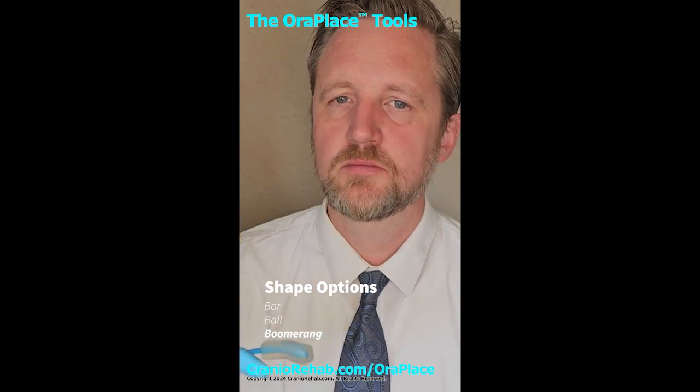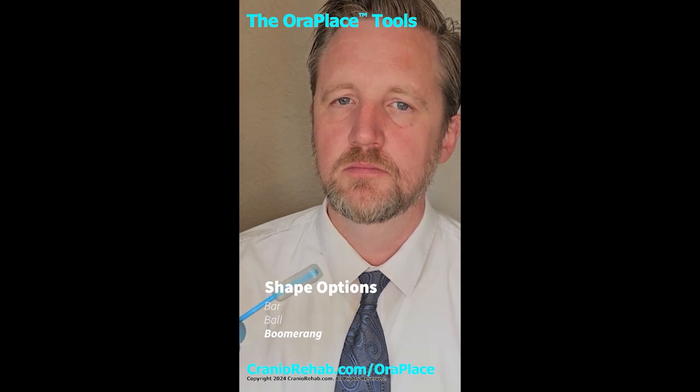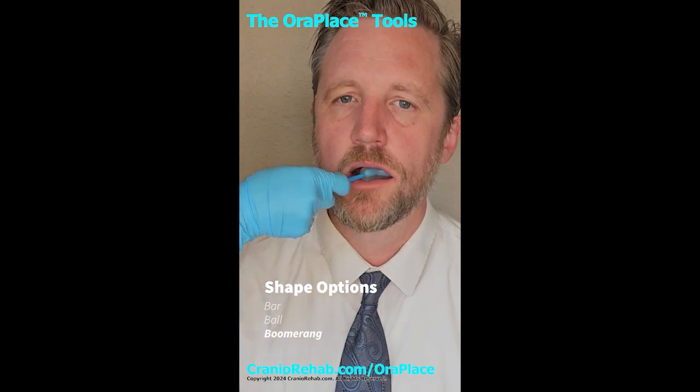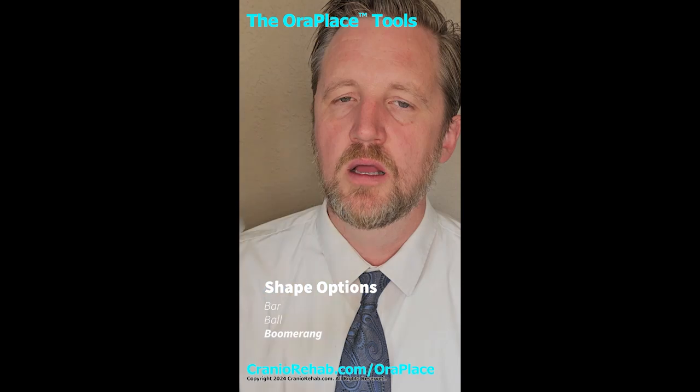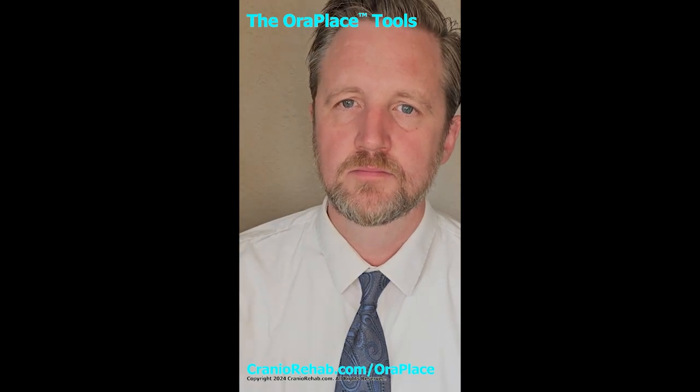You can also use the tip of the boomerang shape, pointed outwards to target the modiolus if the patient's opening doesn't allow for use of the small ball shape. So that looks like this. And you can see that nice stretch. One thing to keep in mind is that just because you're using the large size of one shape does not mean you need to use the large size of the other shapes. For example, you can use a large bar shape and a small boomerang shape.